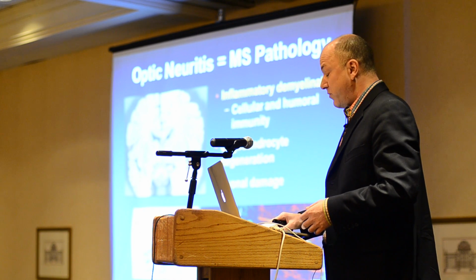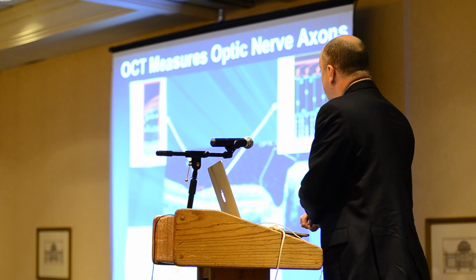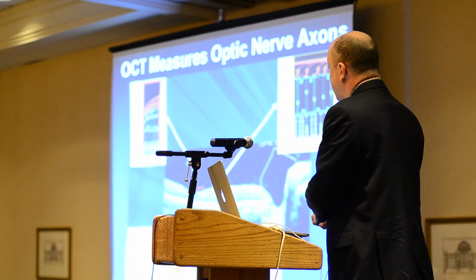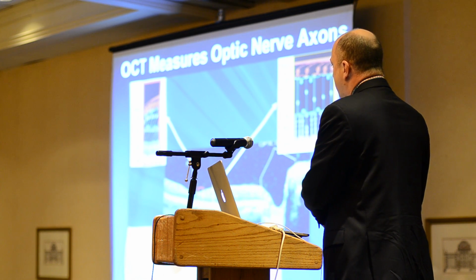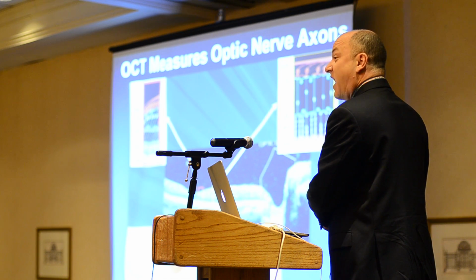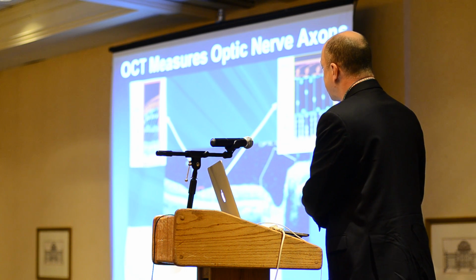But when we do OCT and we're measuring the front of the eye here, through the eye into the retina and the beginnings of the front of the optic nerve, that white matter or myelin is only gathered up by the nerves after all these cables from cells inside the eye that are producing the cables that make the optic nerve exit the eye.